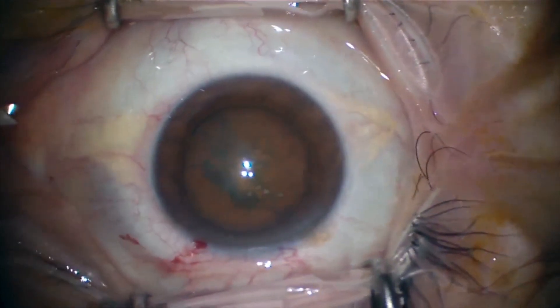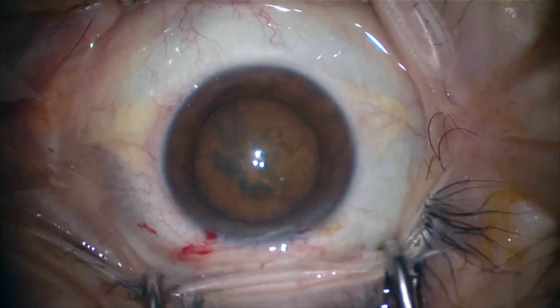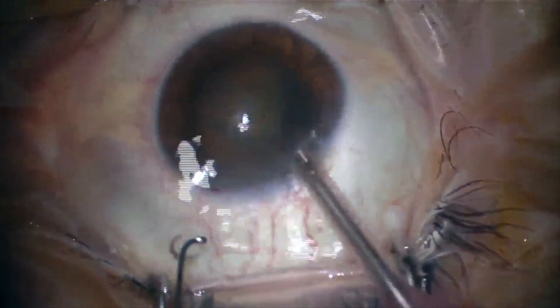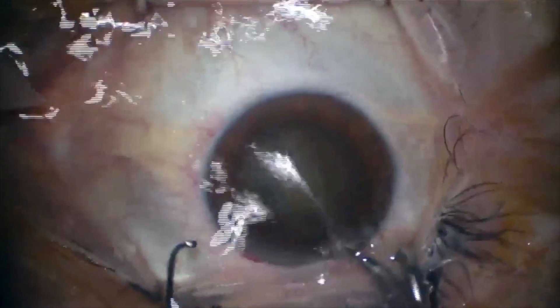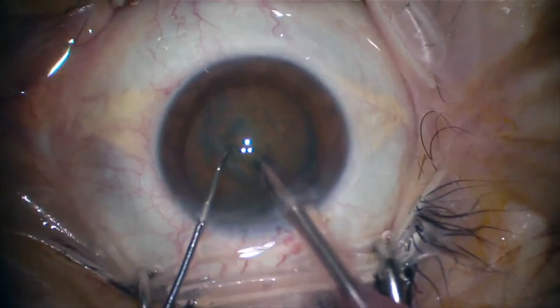We have to make sure that the nucleus is free, so we rotate the nucleus. Once the nucleus is free from the bag, we proceed with the phacoemulsification technique. We are using the Infinity phaco system by Alcon with very specific parameters, which we will discuss in another video.